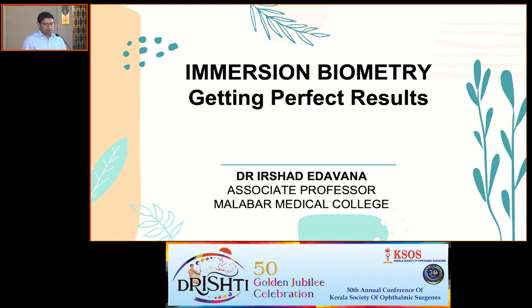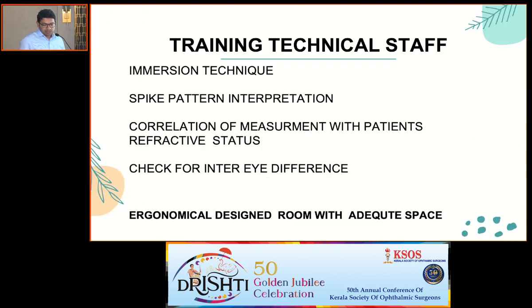Good morning. I'm going to present about immersion biometry: getting perfect results. In this era, most surgeons in government hospitals, or those who do not have availability of any optical biometer, constantly have to use an ultrasound biometer. In ultrasound biometry, the most important thing is training your technical staff. You have to spend a lot of time on this training, and you have to modify it accordingly.